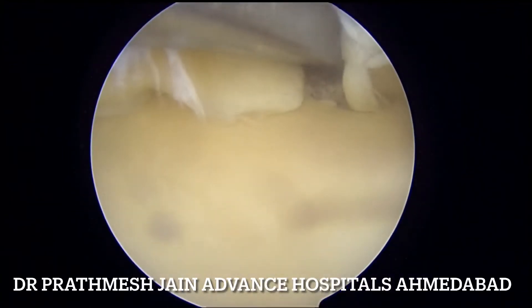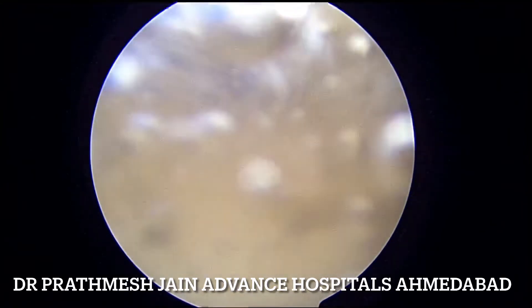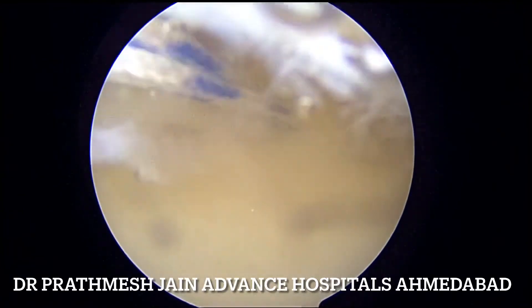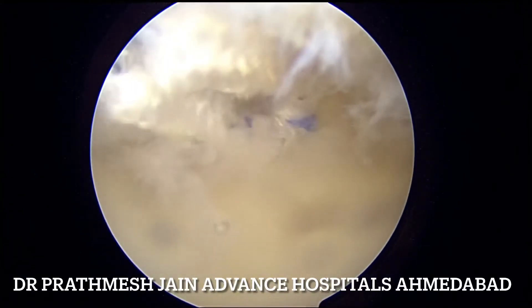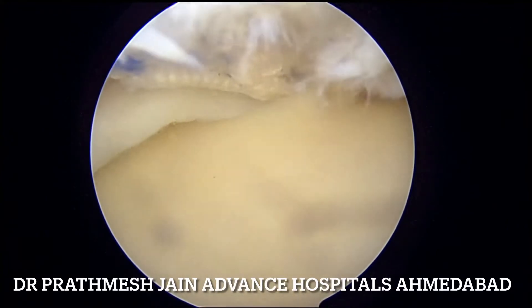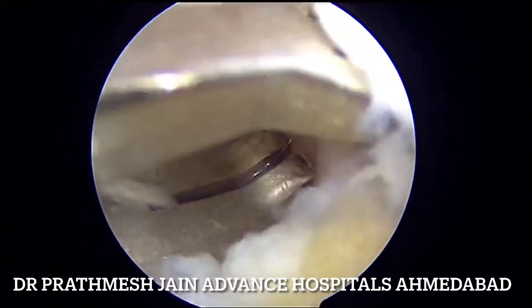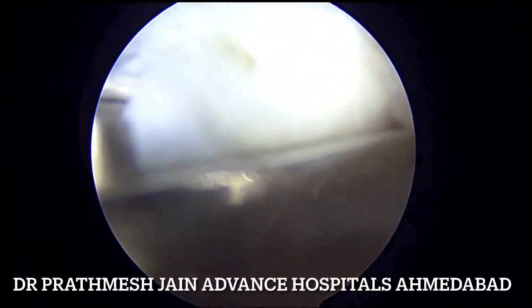At this point we will be using the root fix anchor. A root fix anchor is a wonderful device to close the radial component of this complex pattern of the tear. You can see that the root fix anchor is going into its place. Once the root fix anchor locks into place, we put it right at the location where the radial component is.